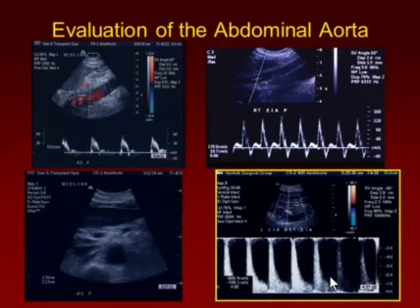When we evaluate the abdominal aorta here, you can see this is the proximal aorta sample being taken parallel to the wall, and you would do proximal, mid, and distal. If there are any increases in size in the aorta as you go down, obviously we're going to measure those. We want to be, as in this example of the external iliac artery, parallel to flow at an opportune Doppler angle to get the optimum waveform. When you do encounter a stenosis, as seen here in a common iliac artery, we want to sample prior to the stenosis, within the stenosis, and document the peak systolic velocity, and then also document the post-stenotic turbulence that's present.